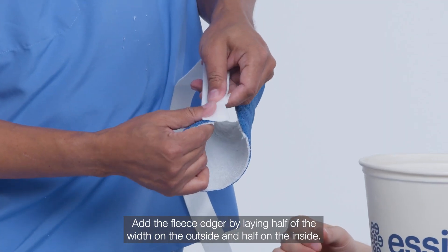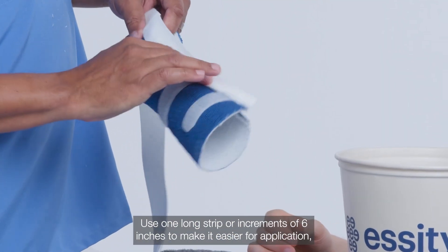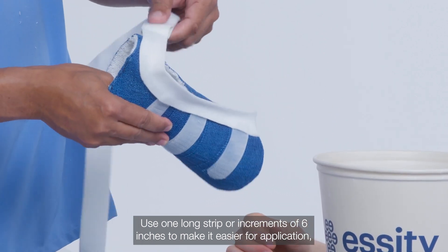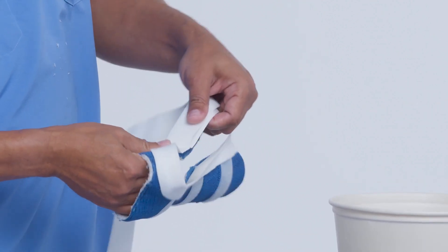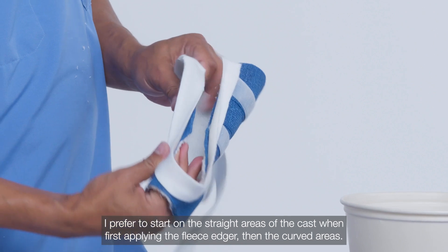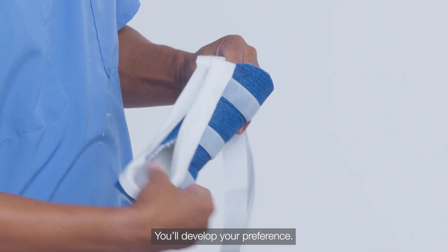Add the fleece edger by laying half of the width on the outside and half on the inside. Use one long strip or increments of six inches to make it easier for application, especially around the rim or the more curved areas. I prefer to start on the straight areas of the cast when first applying the fleece edger, then the curved areas — you'll develop your own preference.